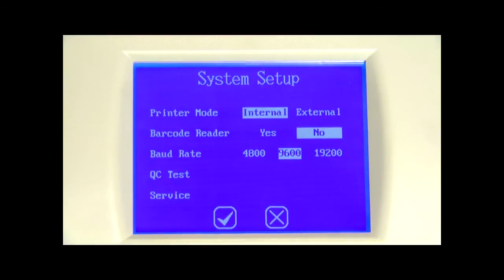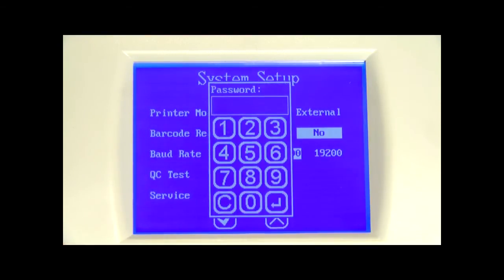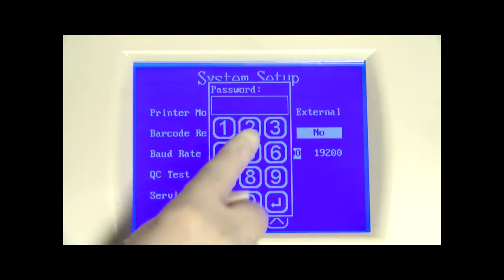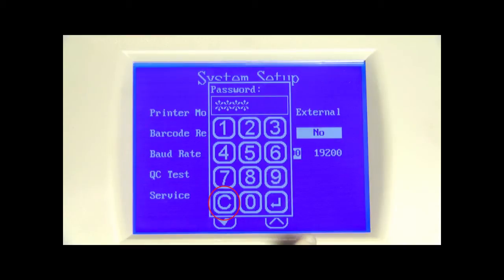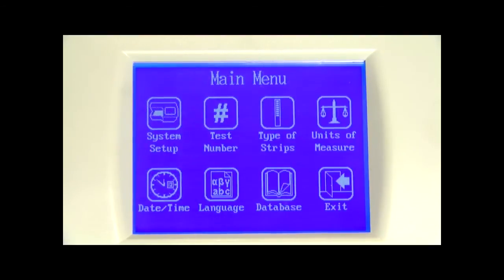The last option in the system setup is service. From the system setup menu, press service to show the password entry screen. Enter the required password to perform any service-related operations. Press the C button to clear the last number entered, and press the enter icon to accept the number and enter the service screens. Once all selections are complete, press the check mark to save the selections and return to the main menu screen, or press the cross mark to cancel all changes.